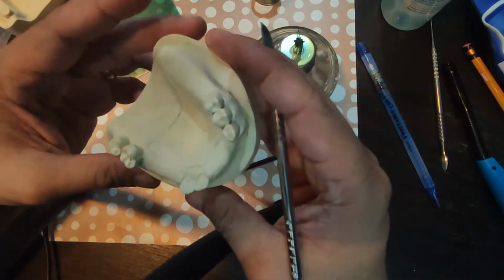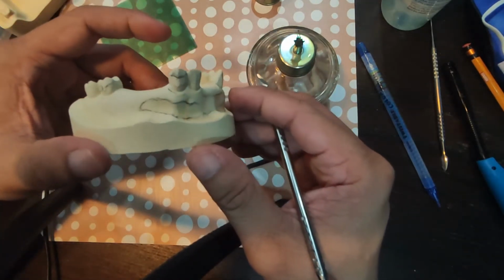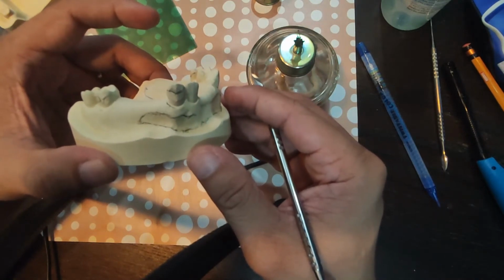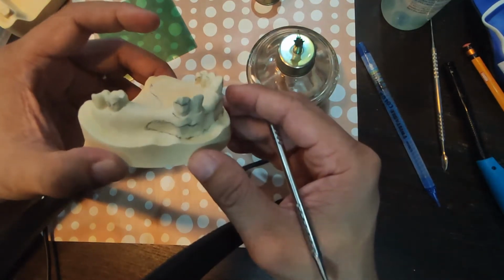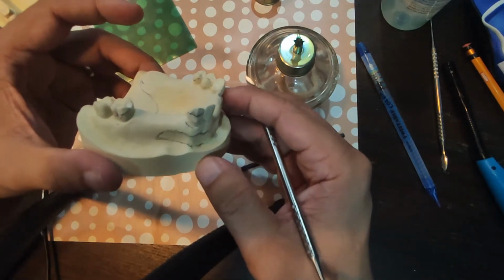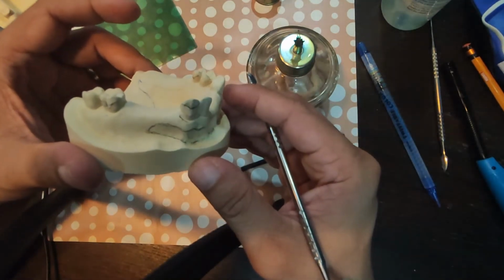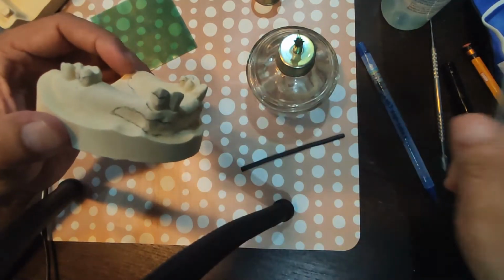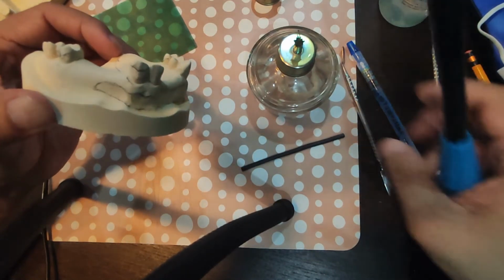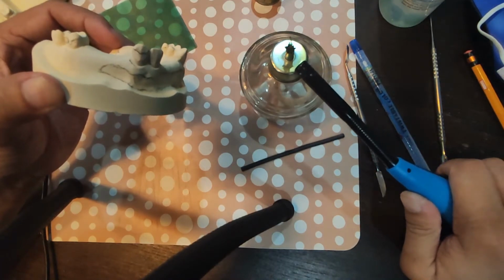Okay, so the first thing we need to do is I usually start off with parallel blockouts. Some faculty members would require you to use plaster, no? Me, I'm okay with using either plaster or wax. So para mas madali, maybe you can use wax na lang. Be careful with using your alcohol lamp, guys, okay? Let me remind you again.